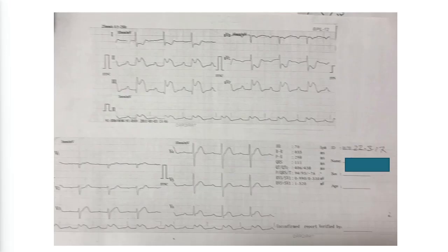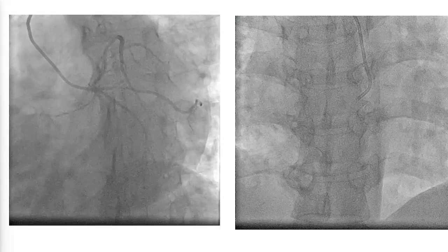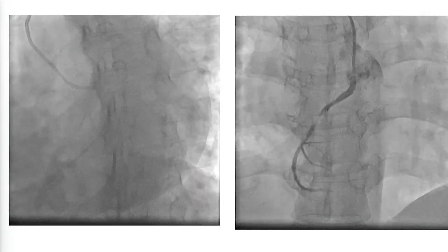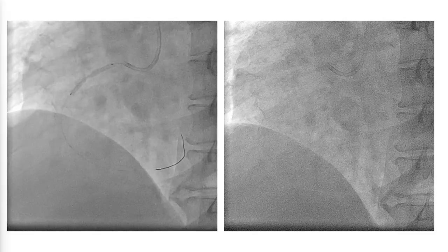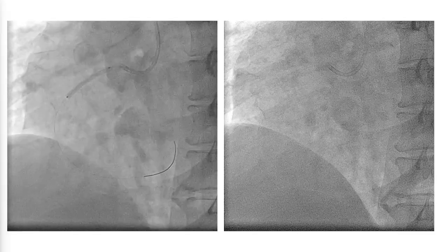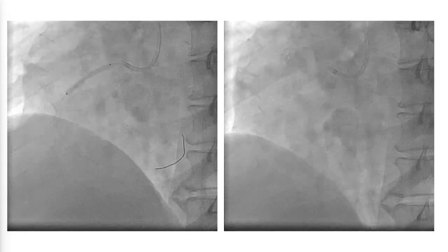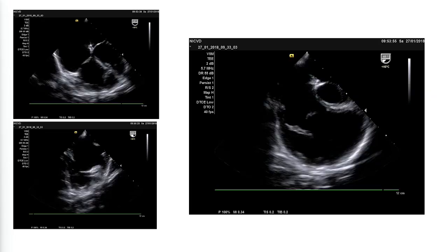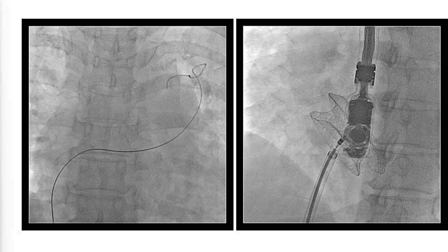This is another case of inferior STEMI presented within six hours. We performed primary PCI on the right side, and two days later ASD was diagnosed. After two weeks we deployed a large ASD device.